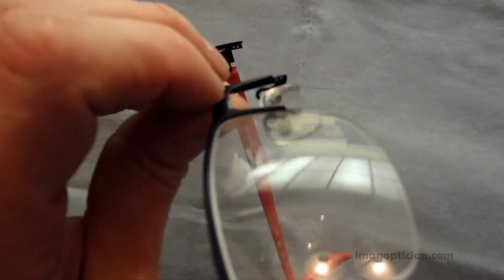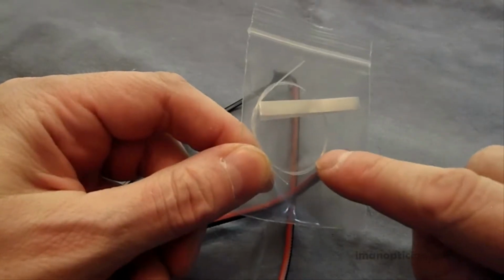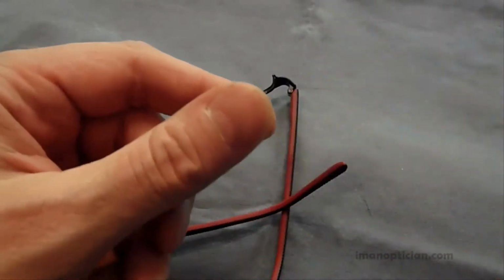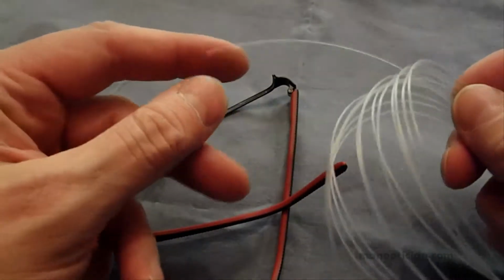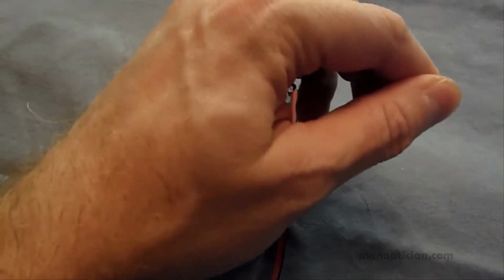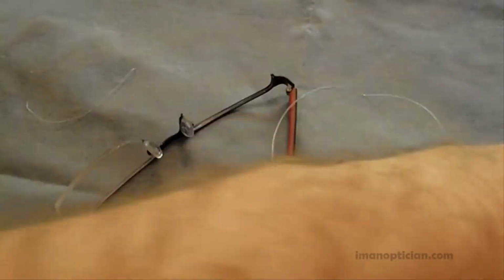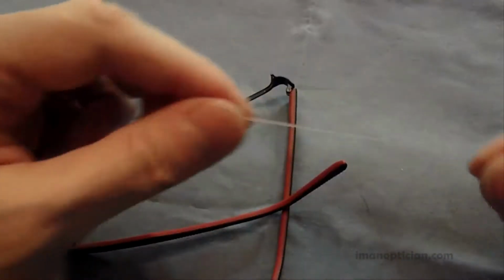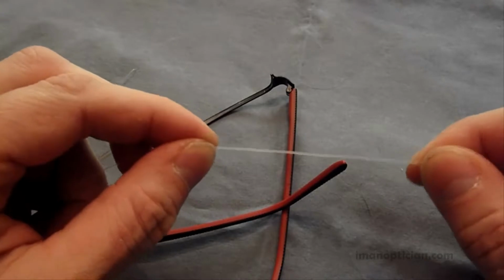So when you use your new eye wire, a lot of times you'll get a package like this with your frame. You can save these up and use this little piece. You can buy it from your supplier. I get it in a big roll. I go down to my sporting goods store, get some fishing wire. You want to make sure that you get a roll that's clear. This stuff comes in blue. It also comes in opaque white, and you don't want those. You want the clear variety.